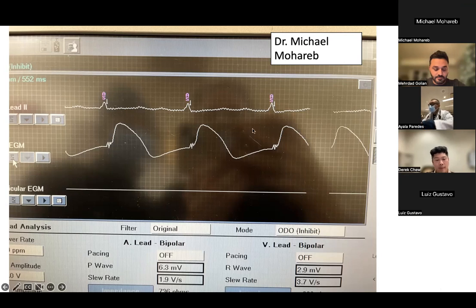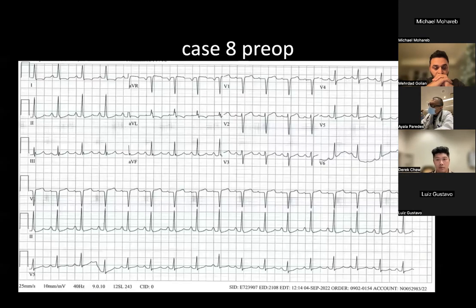It's a really quite quick case, but essentially looking at this current of injury here, which I thought was appropriate after this article. So what does this represent? Go ahead, Michael. Sure. This was a patient in whom we tried to put in a dual chamber left bundle area pacing lead. This was her pre-op ECG, and her indication was a medical need for beta blockers, some intermittent AV block, and some sinus node dysfunction as well.